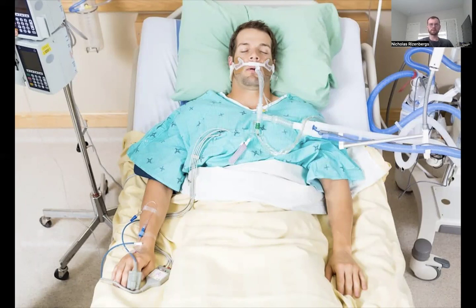So my role in the successful weaning and removing of the positive pressure ventilation, of getting him off the vent, would be first assessing that he is able to wean and is ready to wean. To do that, I'm going to first make sure that he is off sedation and paralytics and that he is awake and coherent and can understand what I'm saying and respond to me. I want to see that there's at least some evidence of a reversal of that respiratory failure, because we didn't put him on a vent because he has COVID or COPD. We put him on a vent because he was going into respiratory failure.